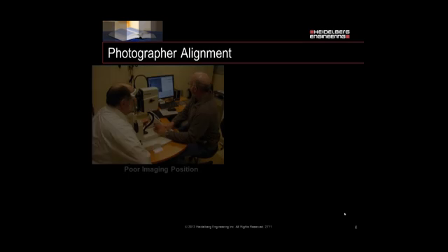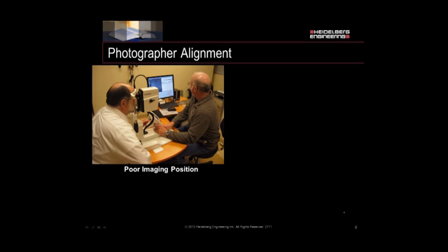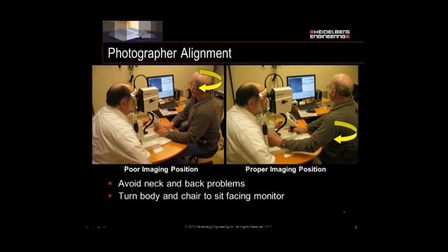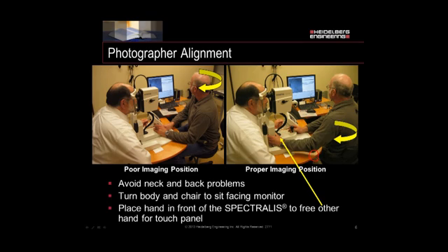Next I'd like to discuss photographer alignment — the way you sit at the camera. Many people sit turned away from the monitor, which causes neck and back problems from turning the head. Instead, turn your body to face the monitor. I like to sit more on the corner of the camera near where the elbow rests. One hand should be placed on the column of the Spectralis and the other on the joystick. If you need to let go of the joystick to grab the mouse, touch panel, or focus on the back of the camera, one hand will always be on the camera itself so you can adjust it if the patient is moving or has difficulty fixating.